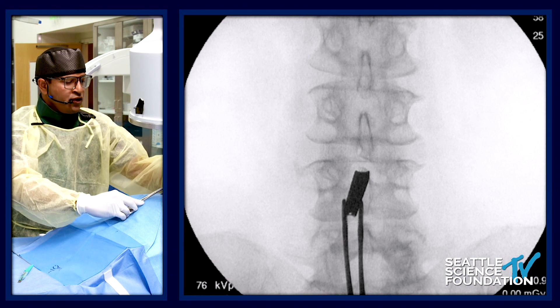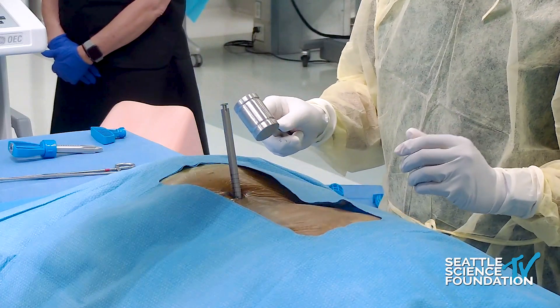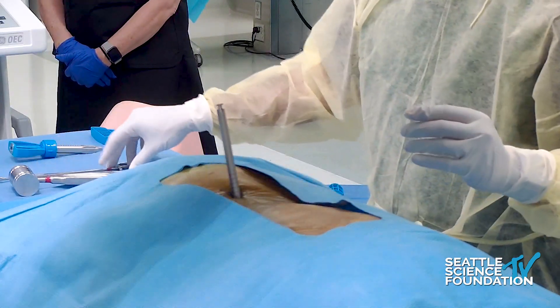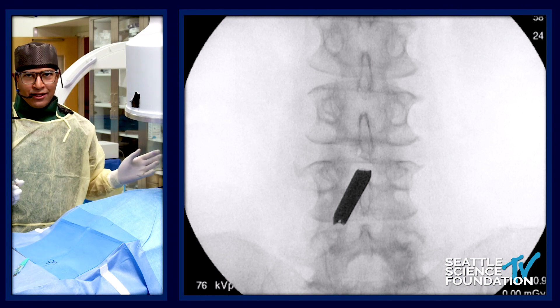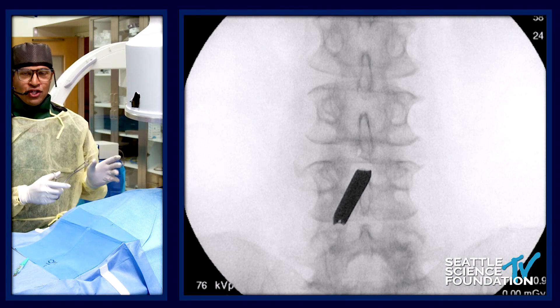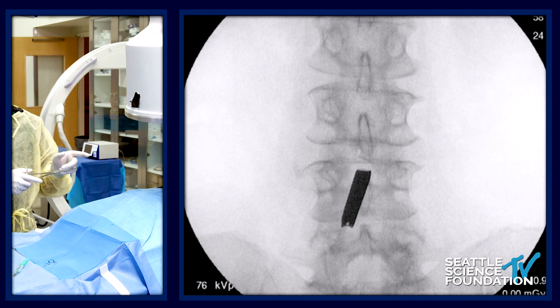If you go in the wrong track right away, you're going to really screw yourself. For the anesthesiologists here — you want to intubate the first time. The second time is a mess, the third time is a disaster, you're calling other people. Just like that adage, you want to be perfect the very first time. We've now got purchase, meaning dilator 1 is standing up on its own.